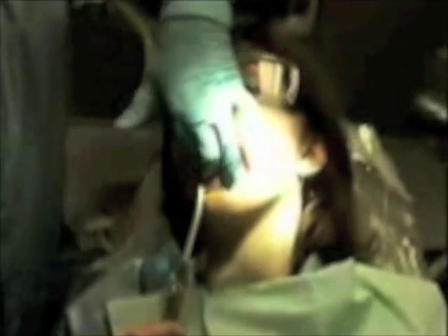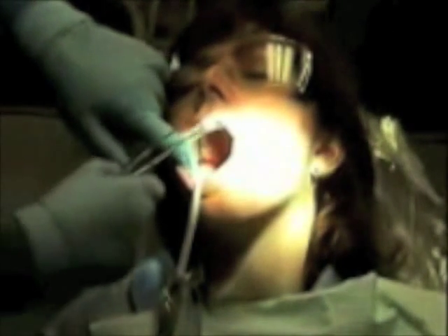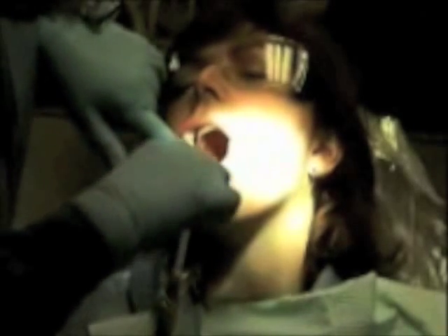When moving to the other quadrant, we would again dry the area and place the cotton rolls on the buccal. Two cotton rolls are placed side-by-side on the buccal. The lip is lifted to get the cotton roll underneath the muscle area.